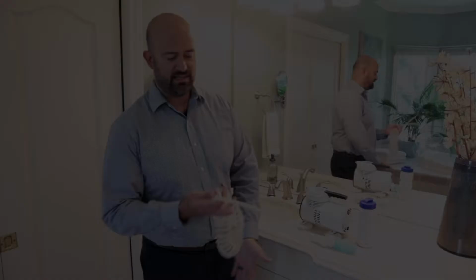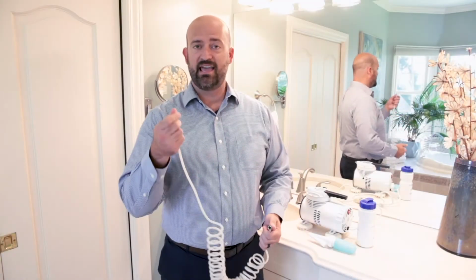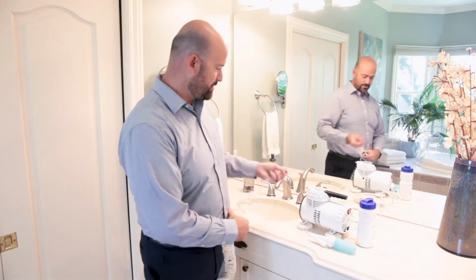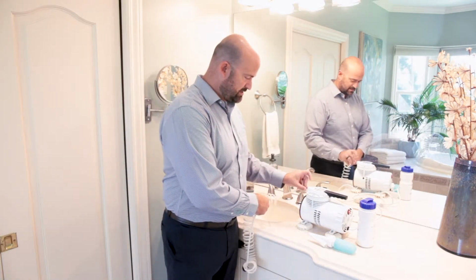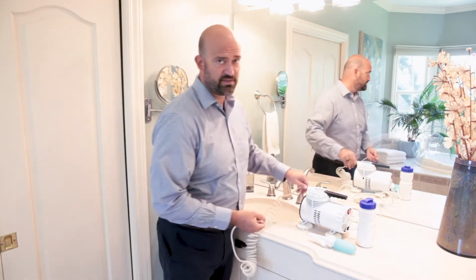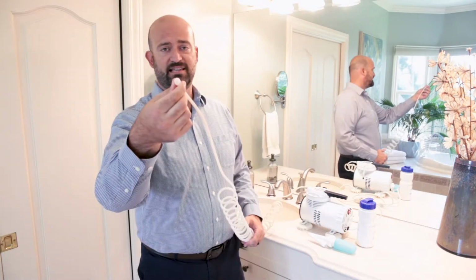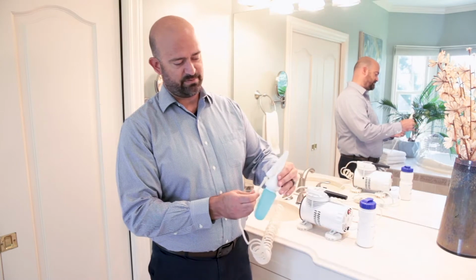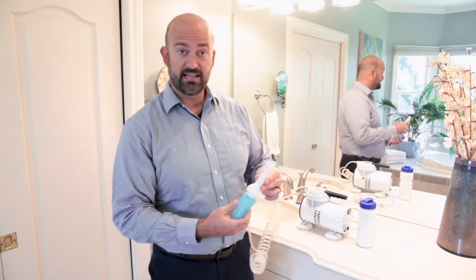Today I want to walk you through a demonstration of how to use the Dental Air Force. The compressor hose has a plastic side and a metal side. The metal side is what we are going to screw directly into the compressor. Screw that on nice and tight. There is a thread at the end of the tube, so we just match that up. We twist it on, nice and secure.